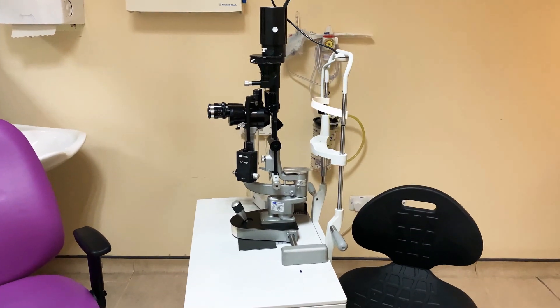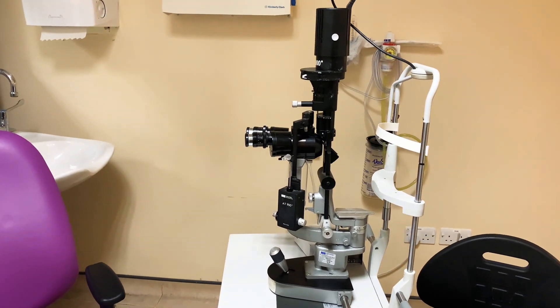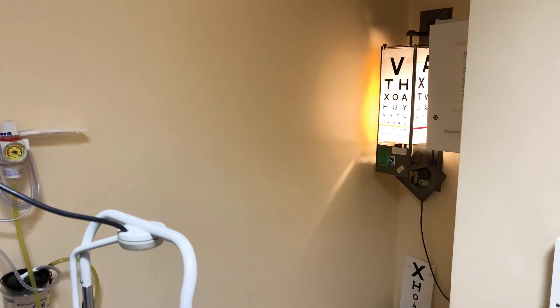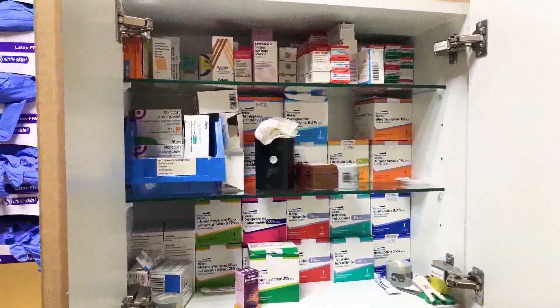Hi there, my name is Sunil Mamtora and I'll be making a quick video for you today on how to use a slit lamp, perform an examination of the patient's visual acuity, and what drops mean what. This is designed for staff at the Royal United Hospital.